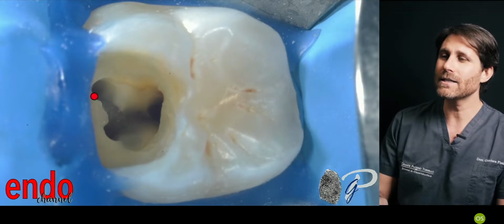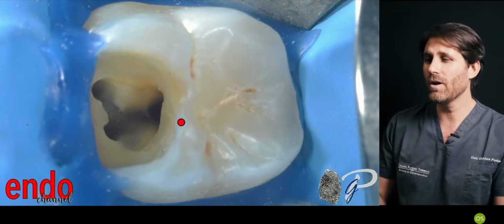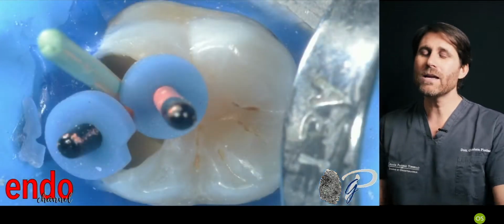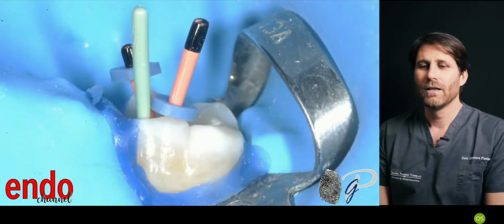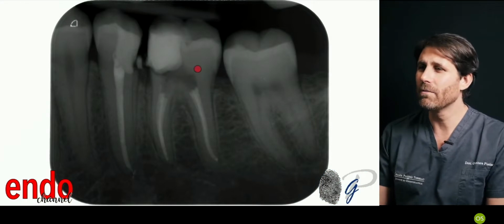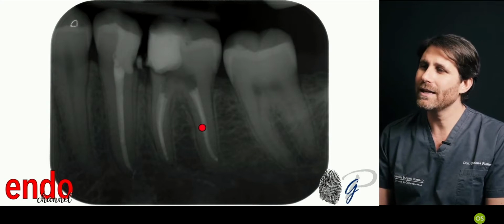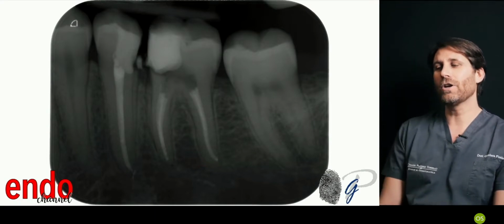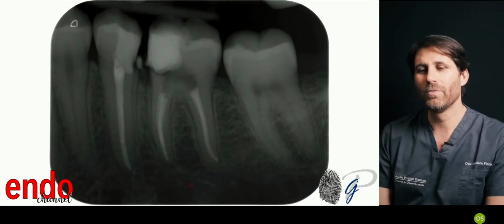The distal canal has an orifice oriented towards the mesial, so we don't need to remove all this soffit. And we can perform all the filling procedures through these spaces after the root canal preparation. And look, no compromises in the quality of the treatment. Two mesial canals, two distal canals confluent with this sharp curvature in the apex, no compromise in how to perform this.